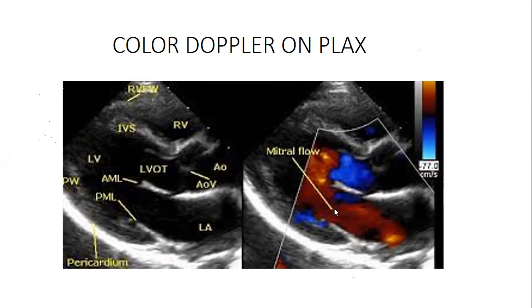As if that is not enough, it goes into the left ventricle, and physiologically, again, it has to continue going to the left ventricular outflow tract. But as it reaches here, remember, blood has to be pumped out of the left ventricle to start going this side now, to come out of the heart. So it's now going away in relation to that. It's now going away, so it will appear blue. So blood in the left ventricular outflow tract looks blue because physiologically it's going away.